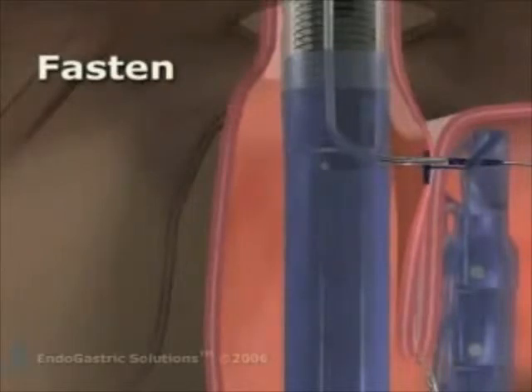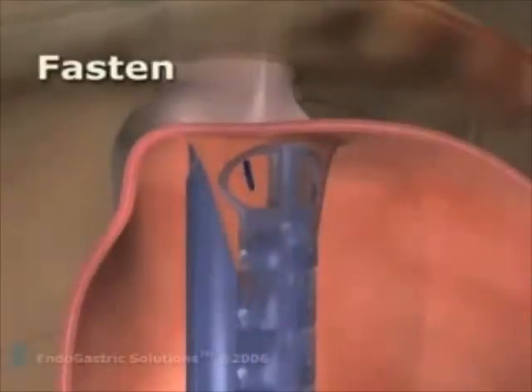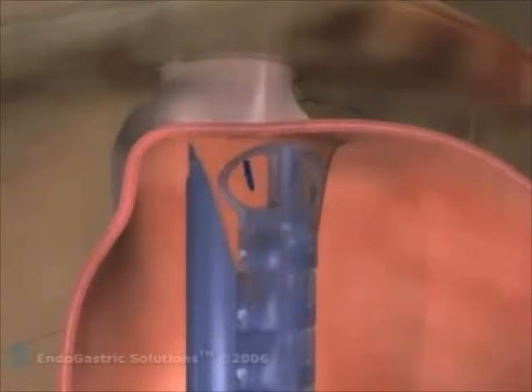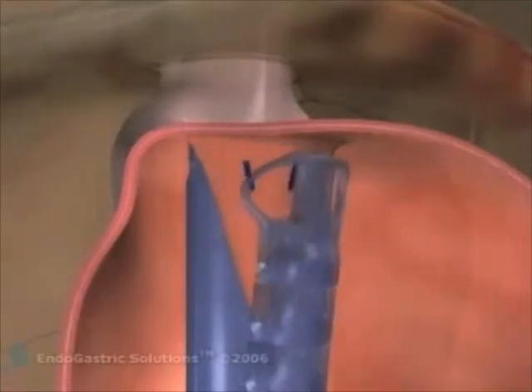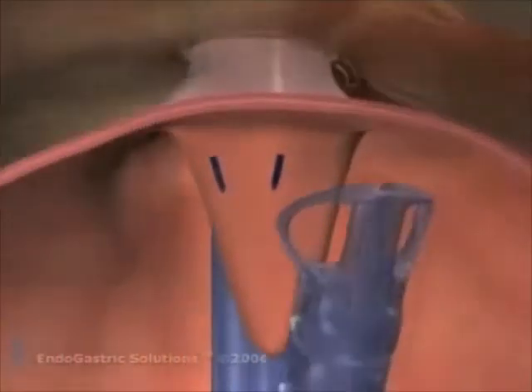From each position, under visual control, the esophagus device can fire two polypropylene H fasteners that ride over a stylet using a proprietary over-the-wire delivery mechanism. These proprietary fasteners have been designed to deliver a serosa-to-serosa fusion of stomach tissue without the compromises of a crimping mechanism. In turn, they will form a robust, precisely placed, interrupted line of sutures.